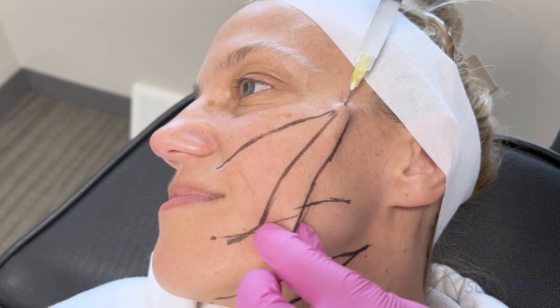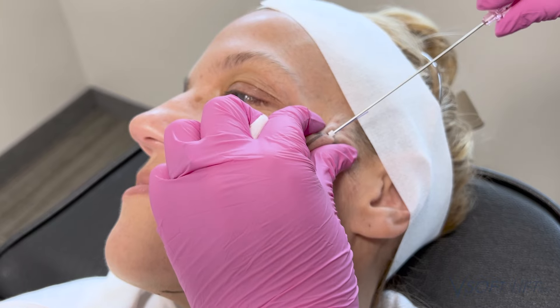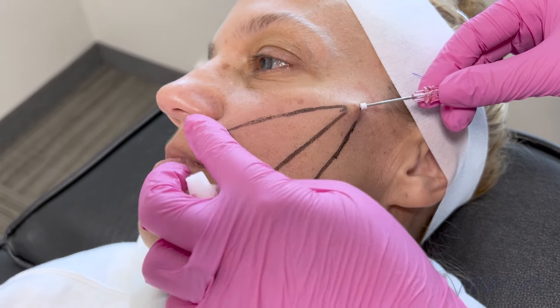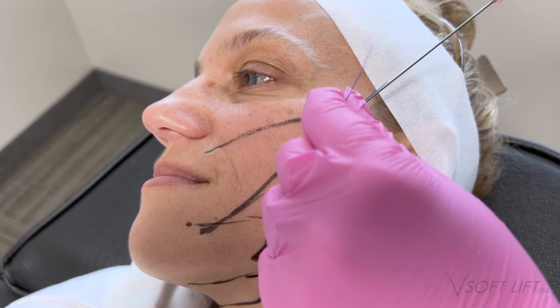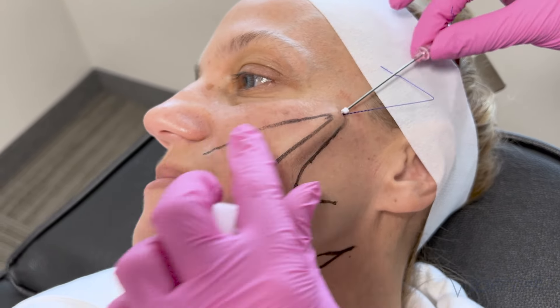She's had Sculptra and smooth threads before, so she's used to these biostimulatory treatments. Now we're going in with our last vector prep — I backed up a little because I felt I was too superficial. I want to make sure I love my depth before placing the thread. With a cannula we can back up and move around, but once we have the thread in it's much harder to adjust. You want to set yourself up for success. Here we're going in with our first thread — a V-Soft Lift Arte 1, 18-gauge — and it slid beautifully right down into the vector.